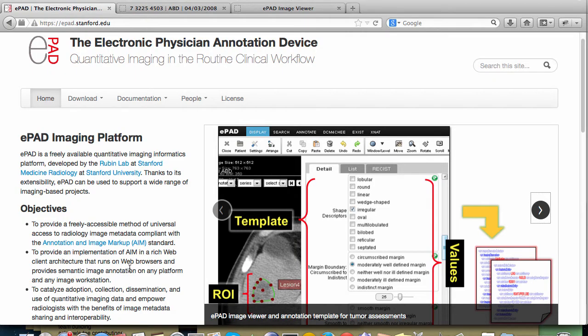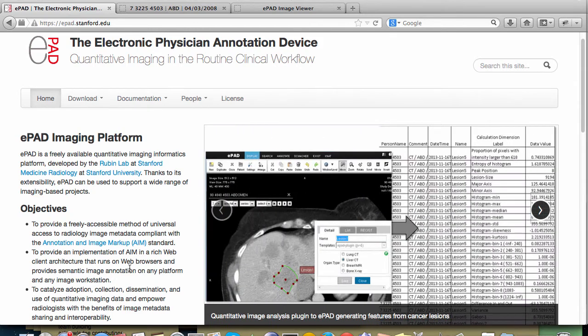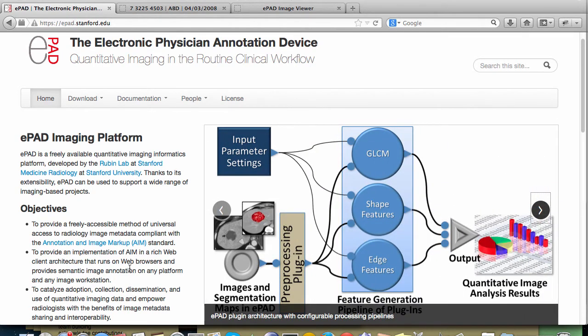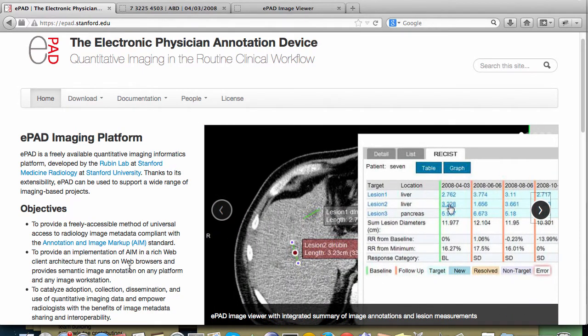Hi, this is Debra Willrett. I'm a software developer at Stanford Medicine Radiology and I would like to show you EPAD, an extensible web-based imaging platform that we developed here at Stanford with the goal of streamlining the process of radiologist interpretation of quantitative imaging studies.